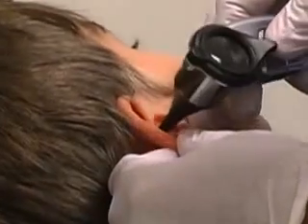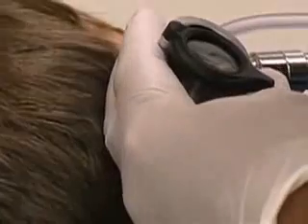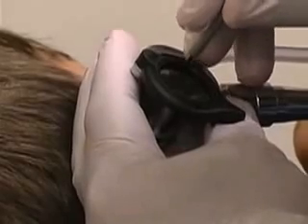With the child fully immobilized, and with the child's head secured by an assistant, insert the otoscope into the external auditory canal using your dominant hand. Once in the proper position, use your non-dominant hand to hold the otoscope in place. Partially displace the lens of the otoscope and insert the blunt ear curette into the speculum.